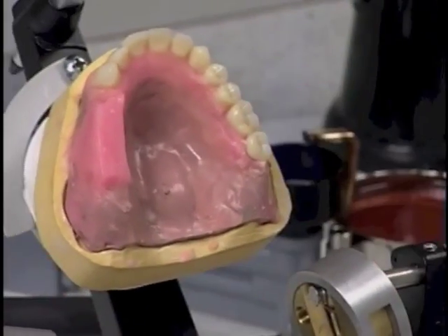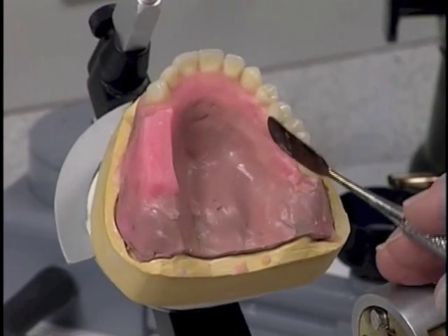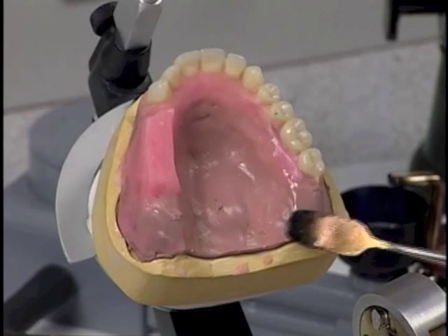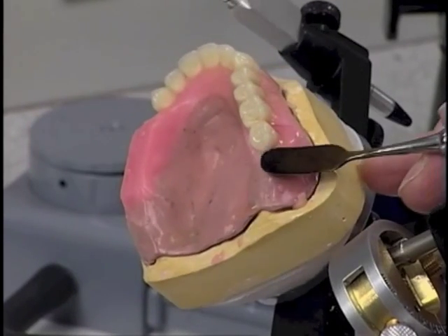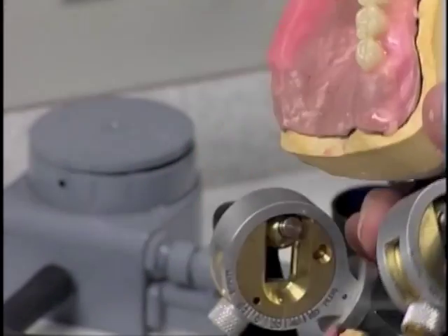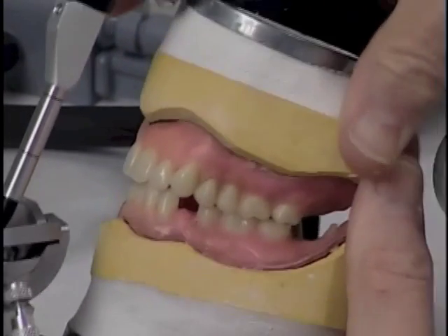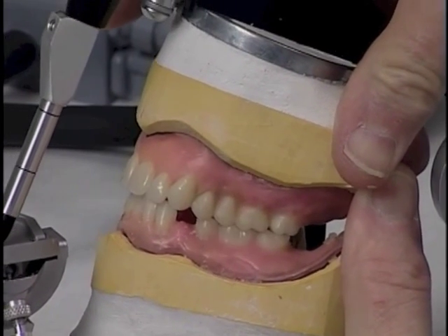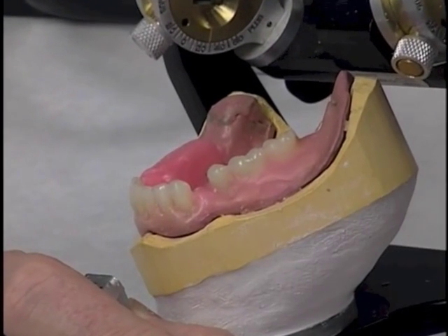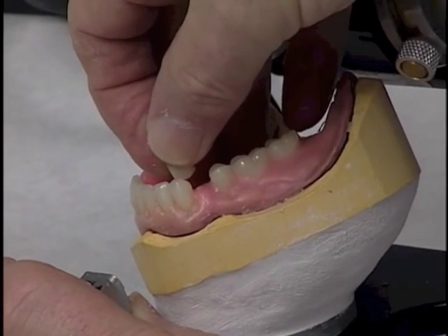So now we're going to stabilize those teeth. After stabilizing it, we check it once again just to make sure we're doing pretty good on contacts. I like that. What we need to do now is to try that first premolar into the space and see if it's going to be the correct dimension.